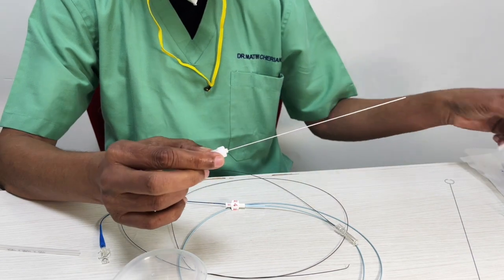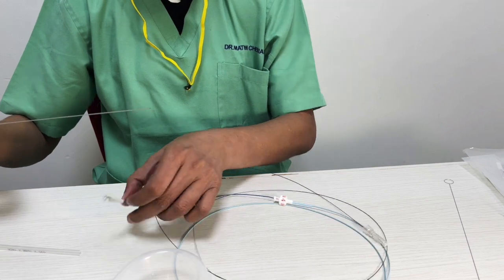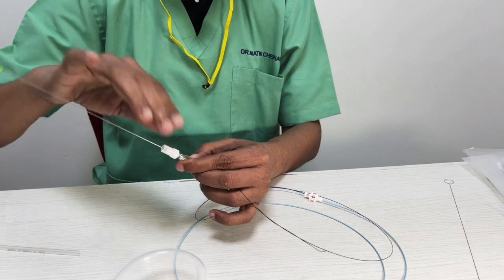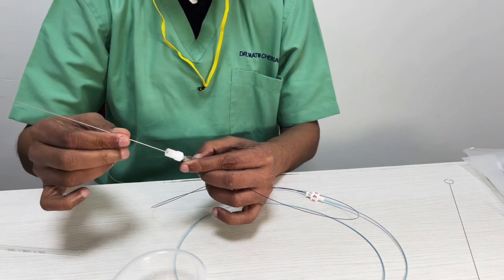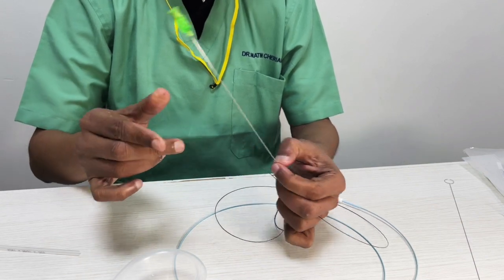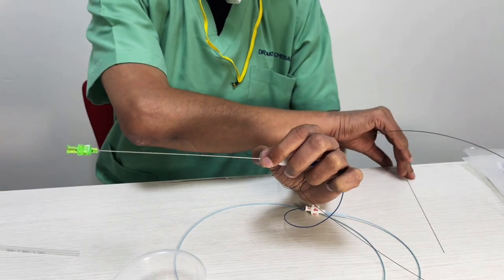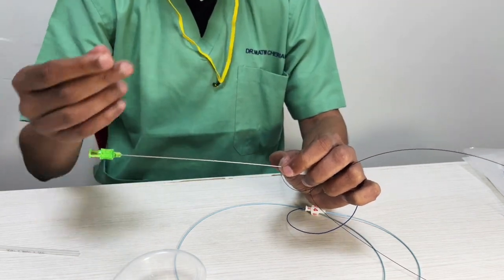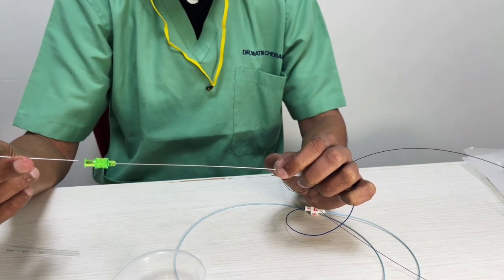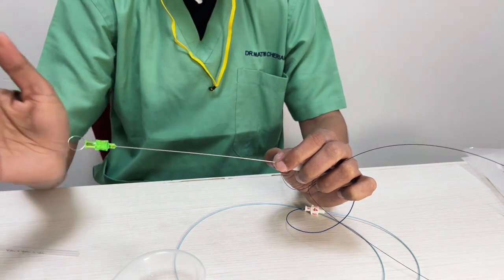So this is it. You've got the same kind of interface to connect. What you've got to do is bring the micro, bring this down and lock it. Once you do it, it becomes single-hand or single-person use. Otherwise, you need somebody else to hold it. So now you pinch it together the way I'm doing it. This is the best way to do it. And then you have to load this from the back. The difference is you have a little bit of a pusher here, which is how you can push it and it gets into the micro.